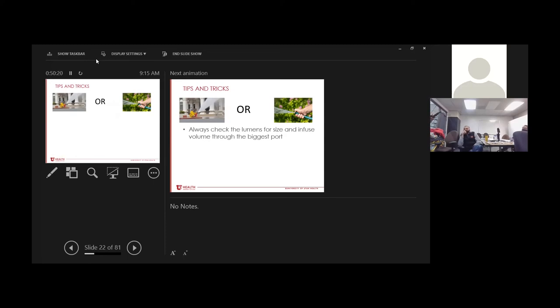Another is the dialysis catheter, which you're rarely going to come across at these facilities, but you could at a larger facility, and a port. If someone has a port, by the time you get to the facility it's been accessed, and they've already pulled the heparin out. But if you were ever at a facility and they were accessing someone's surgically indwelling port, that will be packed with heparin and will need drawn back. But for all of these central lines we're talking about, some facilities flush them with 10 units per ml heparin, but that's a benign amount, and they're designed to be flushed for you. You don't have to pull it out. So for a central port, you're going to need to rely on the nurse.